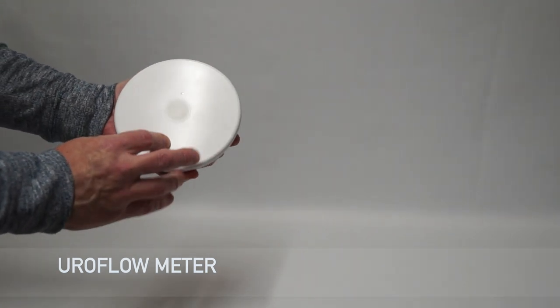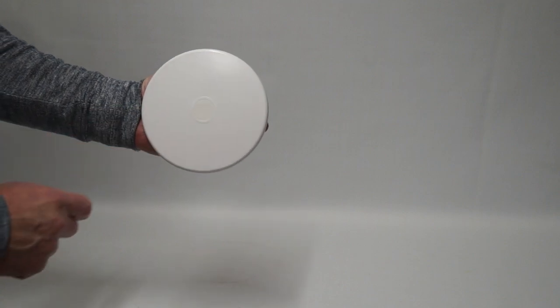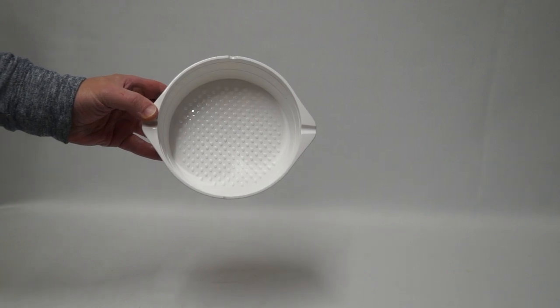The heart of the system is the flow meter. This measures the weight and hence volume of urine that is passed over time, much like how accurate kitchen scales work.